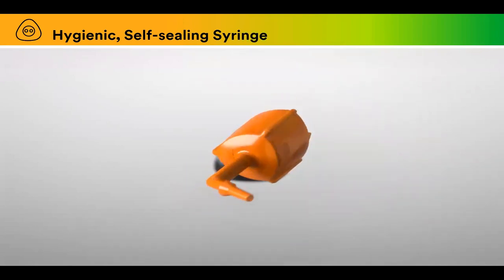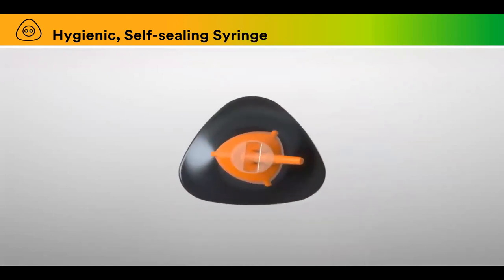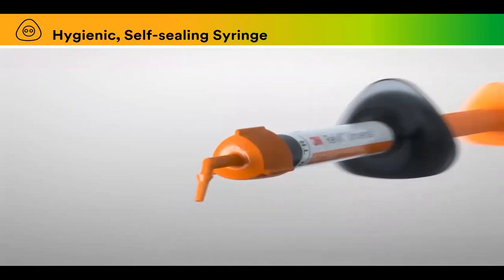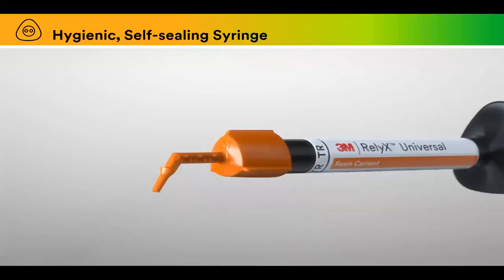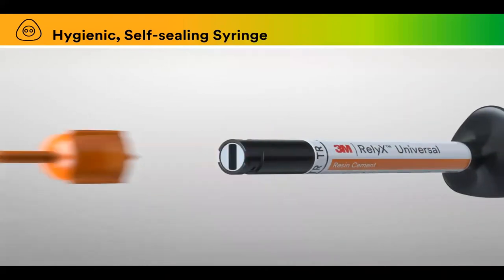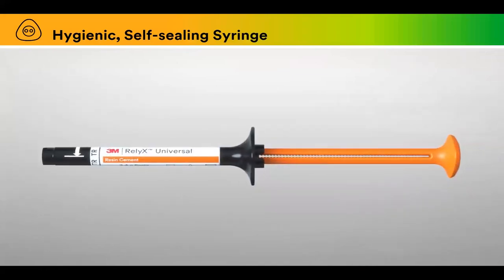You can see that little syringe. It has a little mechanism inside that fits down sort of like a lock and key. And then you turn it, and it opens up the syringe, allows you to dispense what you need. And then you remove the tip, and now the barrel is closed. So that's how you store it.